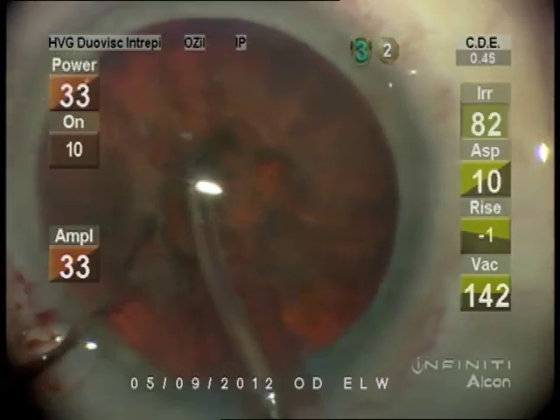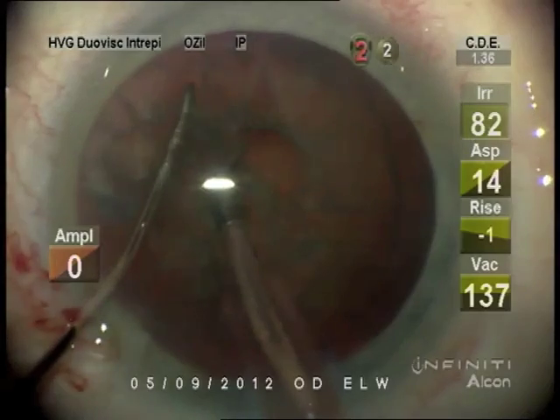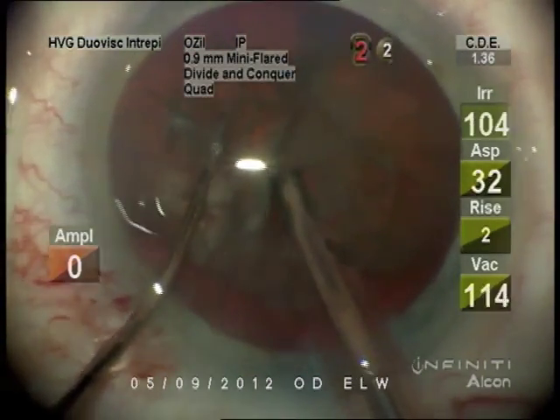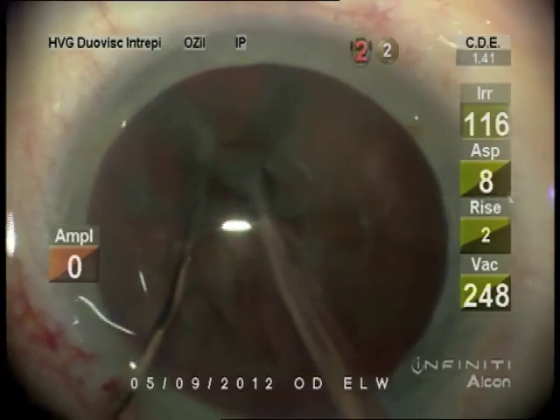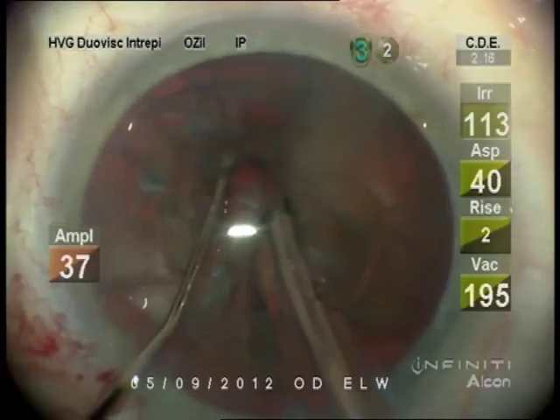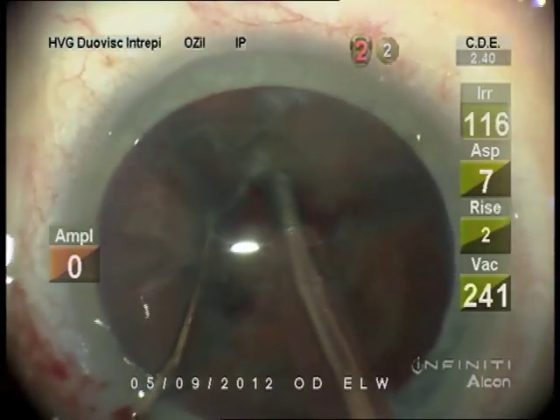Get rid of some of this cortex, epinucleus. Try to keep in mind being in the center of the lens because it fractures better. Now we've turned to the torsional, higher vacuum setting. Depending on the density of the lens, I vary the vacuum setting.